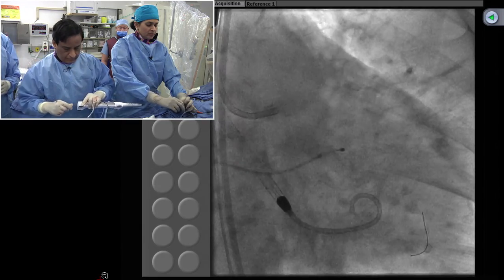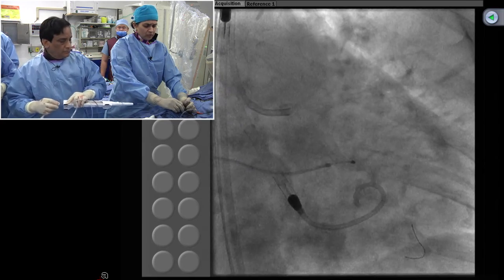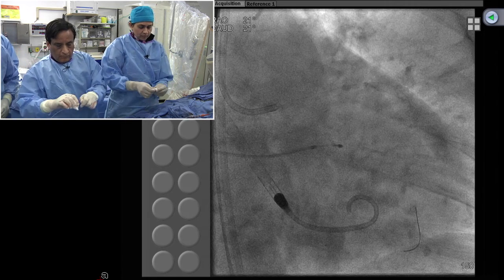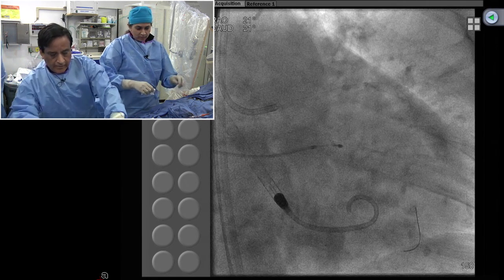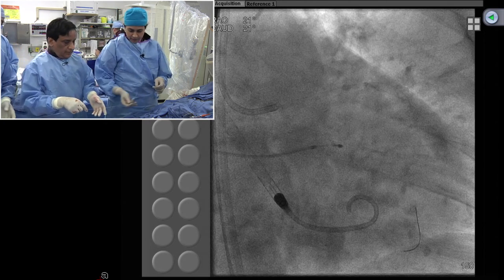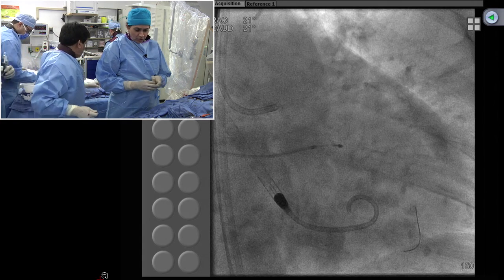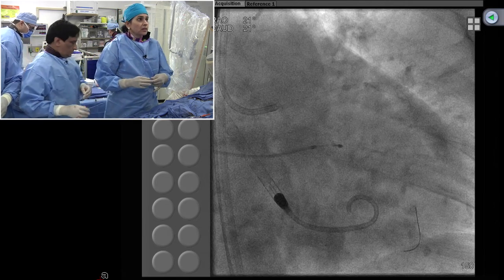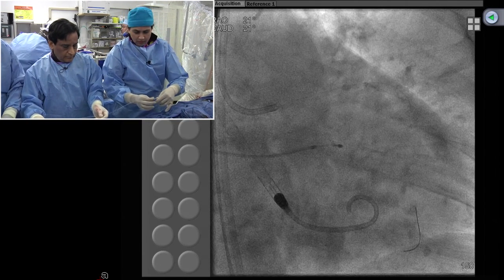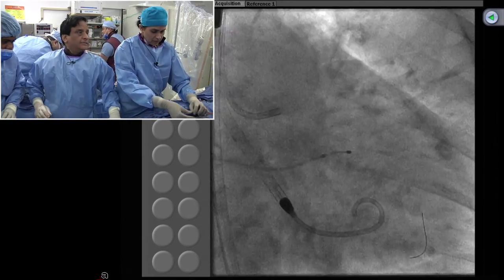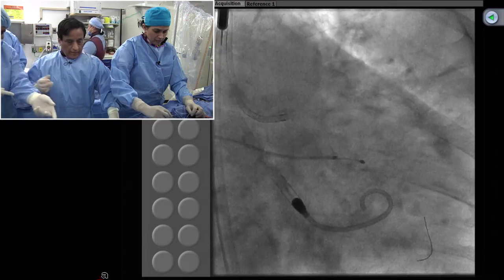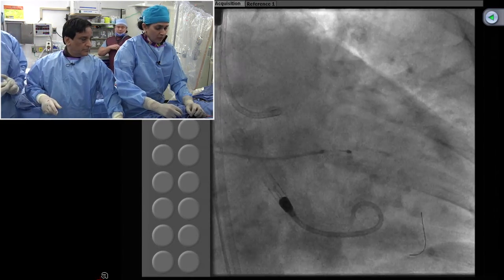The suggestion by Maurice is let's do a balloon dilation first — do we do IVUS now or after balloon? After balloon, okay. If that one fiber wire would go, a cutting balloon would have had trouble getting to that lesion. But this is the whole thing as we started this discussion — why do IVUS? It's an obvious rotoblator case. That's because you're an expert at it, but put yourself on the other side where many people would start with cutting balloon, dissection, another balloon, parallel wire, and all that scenario — that's what has led to so-called 'roto regret.'